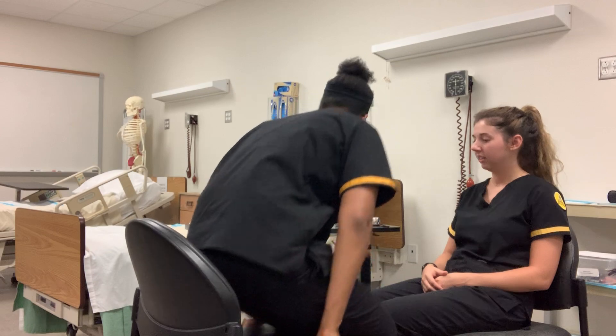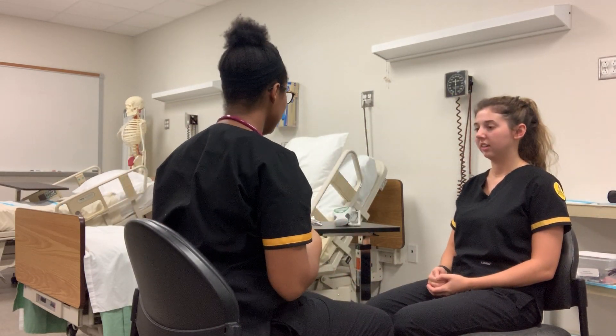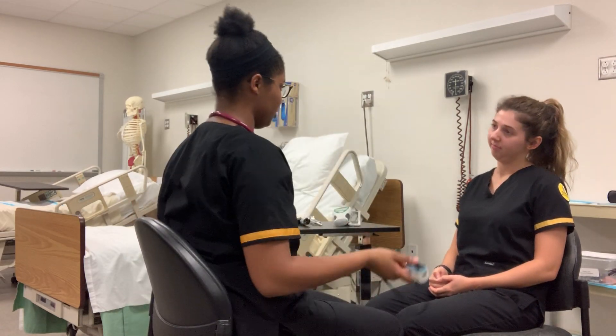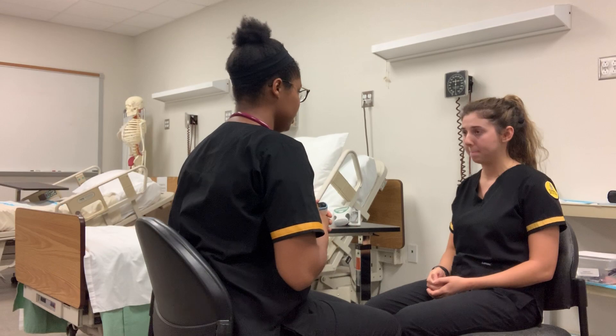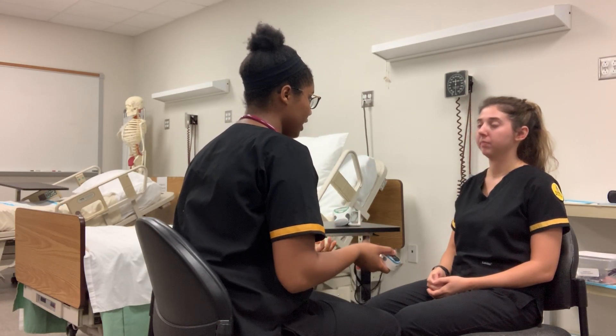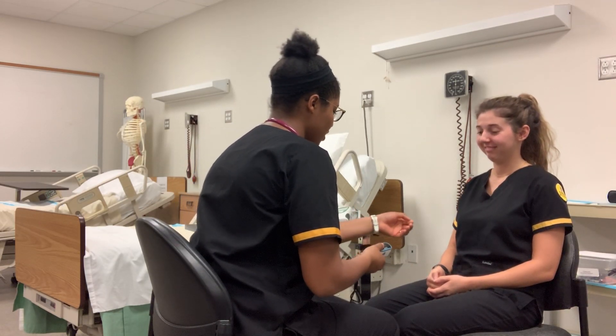So today we're just going to be doing a general health survey. I'm just taking your vital signs, pain assessment, and I'm just checking your nails, eyes, nose, and throat. So you look clean, good posture, you're awake, alert, and oriented times three. You look like you have an overall good general health.